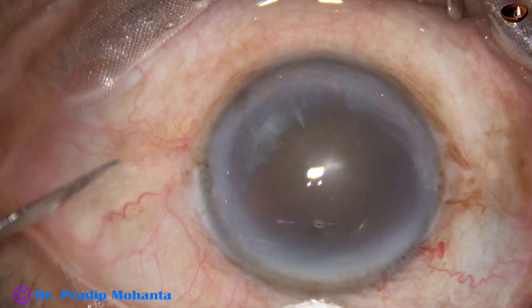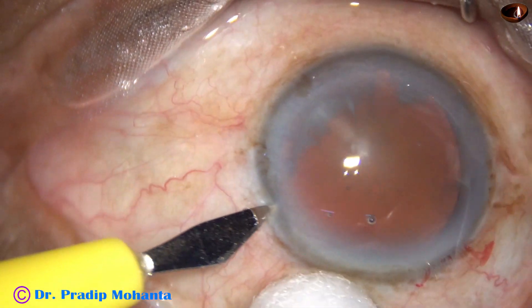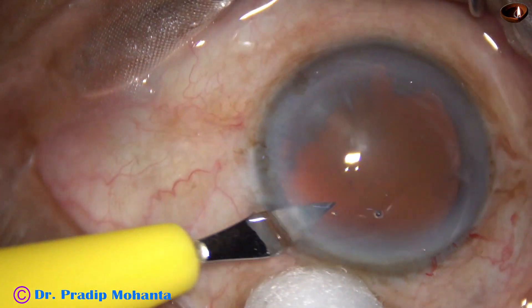Now a side port is made on the left side of the main incision, about 3 clock hours away.